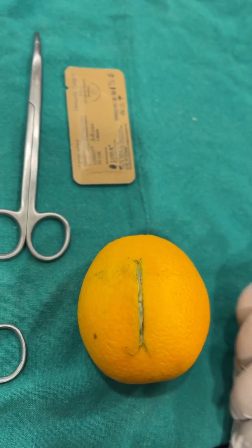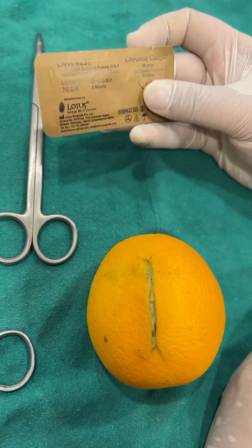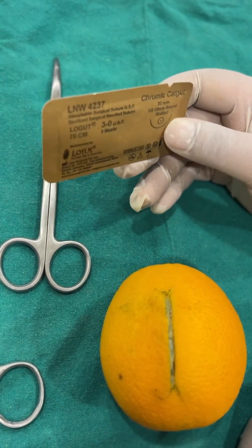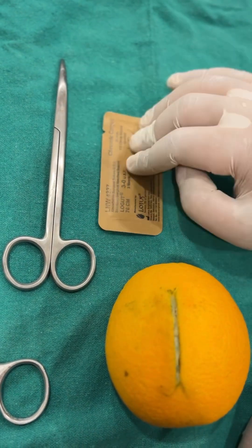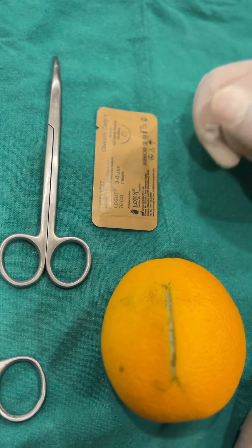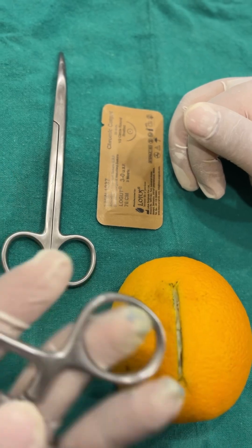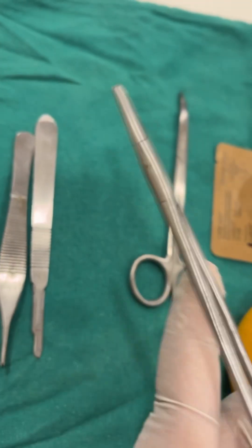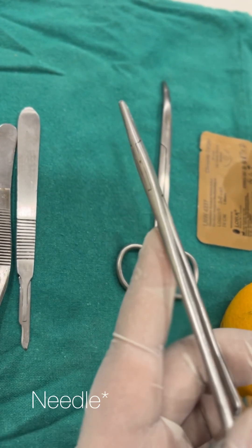Let us move to our next exercise which is suturing. For suturing we need a suturing material. In this case we are using a 3-0 chromic catgut. This is my preferred suture material. I also use 4-0 chromic catgut, 4-0 vicryl, and 4-0 polypropylene. The next instrument is a needle driver — it is a ratcheted instrument used for holding or loading the needle.